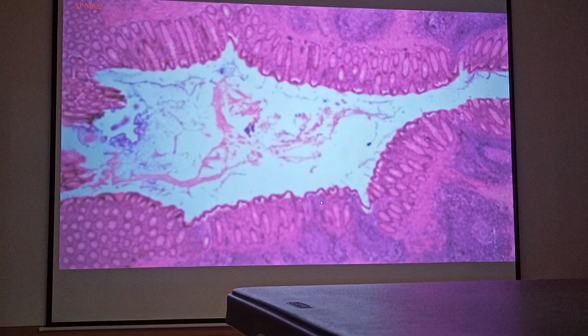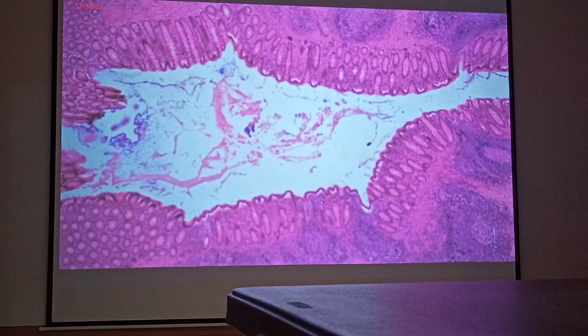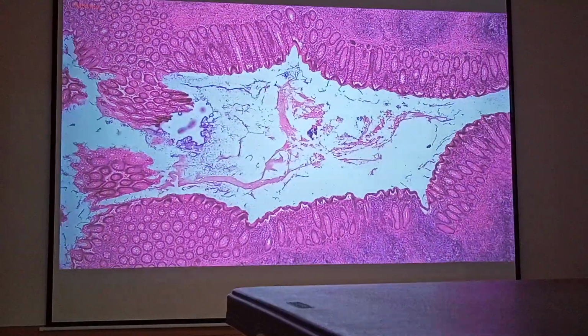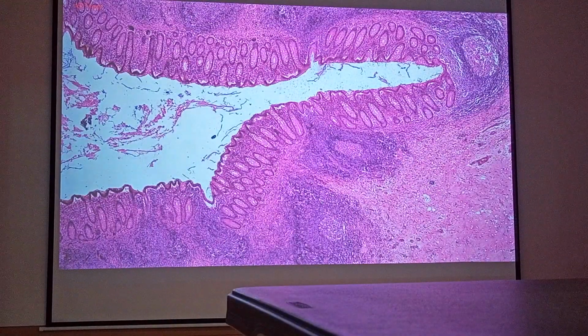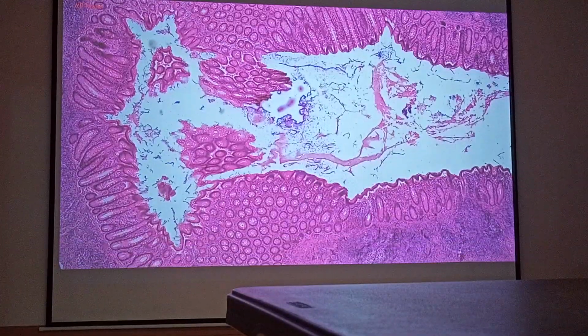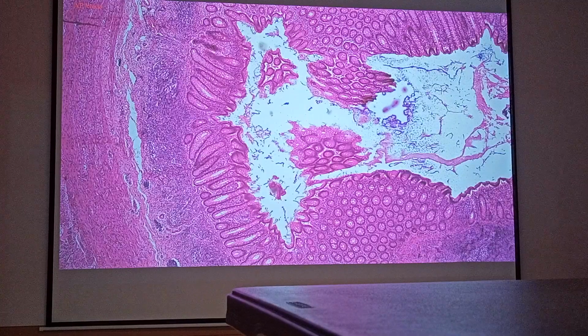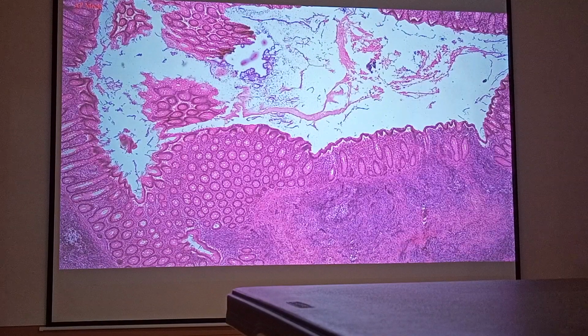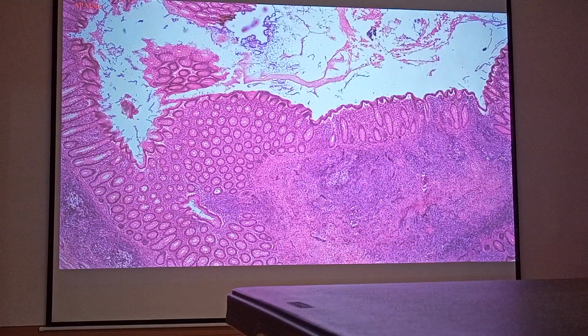Okay, this organ of the gastrointestinal tract is very small. Small because we will be able to see the entire lumen of this organ, the cross-sectional appearance of its lumen, in one slide. Appendix, very good. So what is the epithelium of the appendix? Columnar. How do you call that connective tissue immediately underneath the epithelium? Lamina propria. And surrounding the glands, in the lamina propria, is that thin bundle of smooth muscle fibers, the muscularis mucosae. So this layer is called the submucosa.